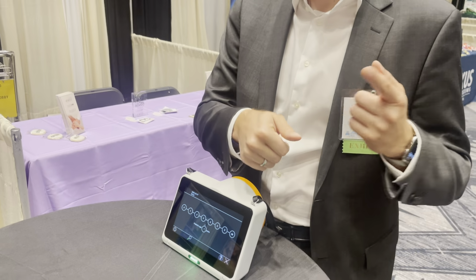Why do we need an age group? We need an age group because with age, the tolerance changes. In a baby, I have a lot more tolerance because it's still developing. But if I'm starting to get 5 years, 6 years, 7 years old, I mean, I should have good eyes by now. I should have good sight. So we tolerate less. So I'm a little older than 6. So I hit the 6, and this is now 6 to 99. If I hit the 1, this is 1 to 2, okay? This is how we work.